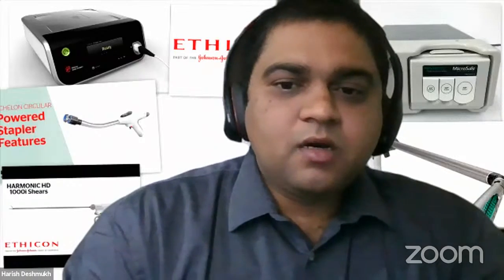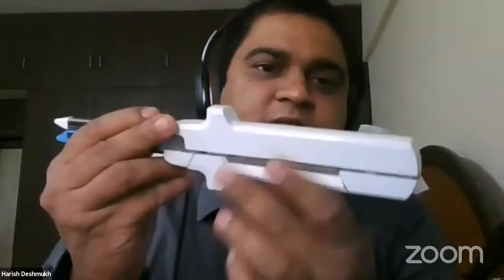When it comes to Advant and this one, there are only two differences majorly. The main difference is that the Advant is a reusable gun, and the one which I am showing now is purely disposable, though in India they reuse it basically. This is called TLC, and the other one which we are using in KLE is Advant. Loading and unloading is the same. There is no major difference. Loading of the reload has the same design. I'll just show it again.